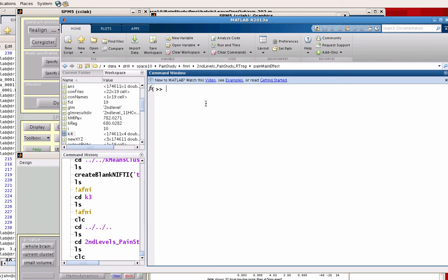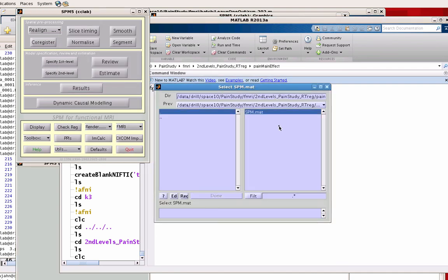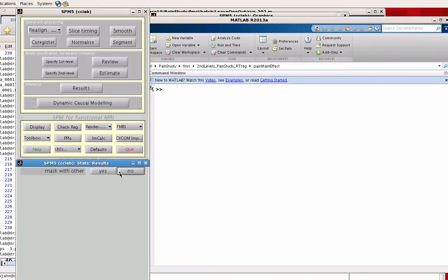You would just get the voxels for just that region and nothing else. We also need all the regressors of interest. We need to put them into a single matrix and then use k-means to determine whether each voxel belongs to one cluster or another.